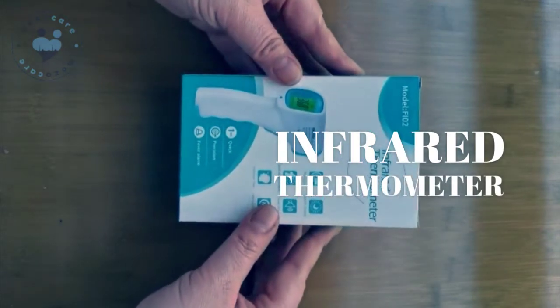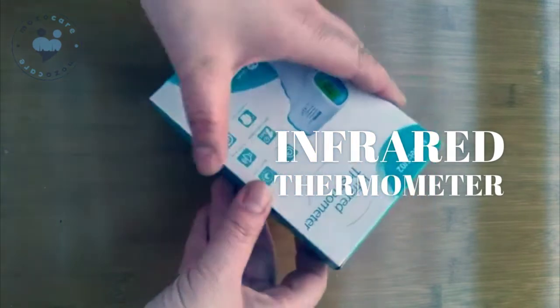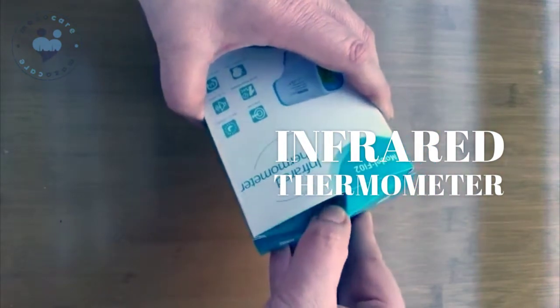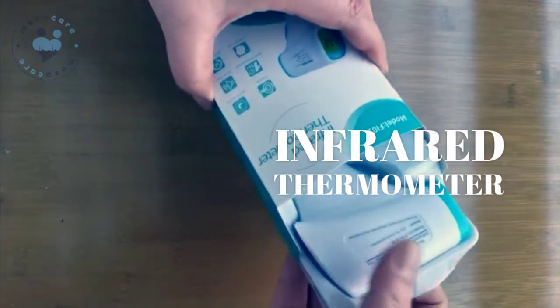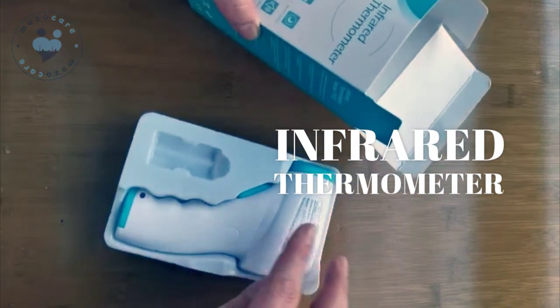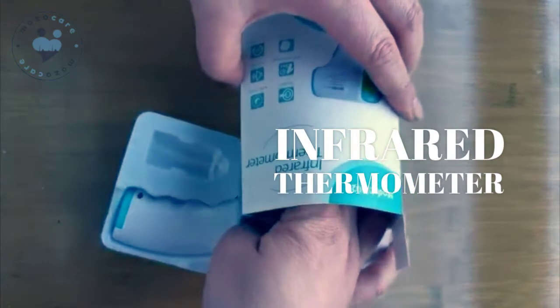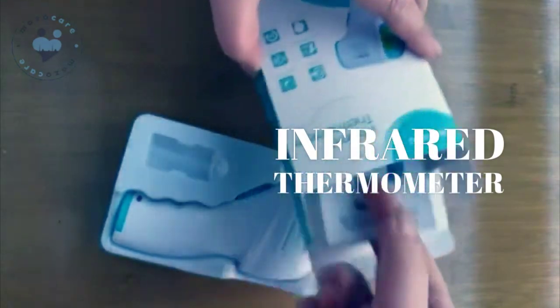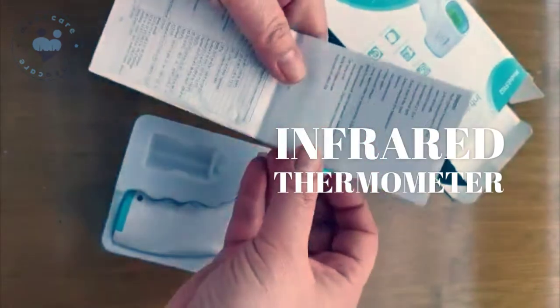This is the thermometer. I want to show you how to use it — open the box. This is the machine inside. We can also find the instruction manual in English, which you can read in detail.